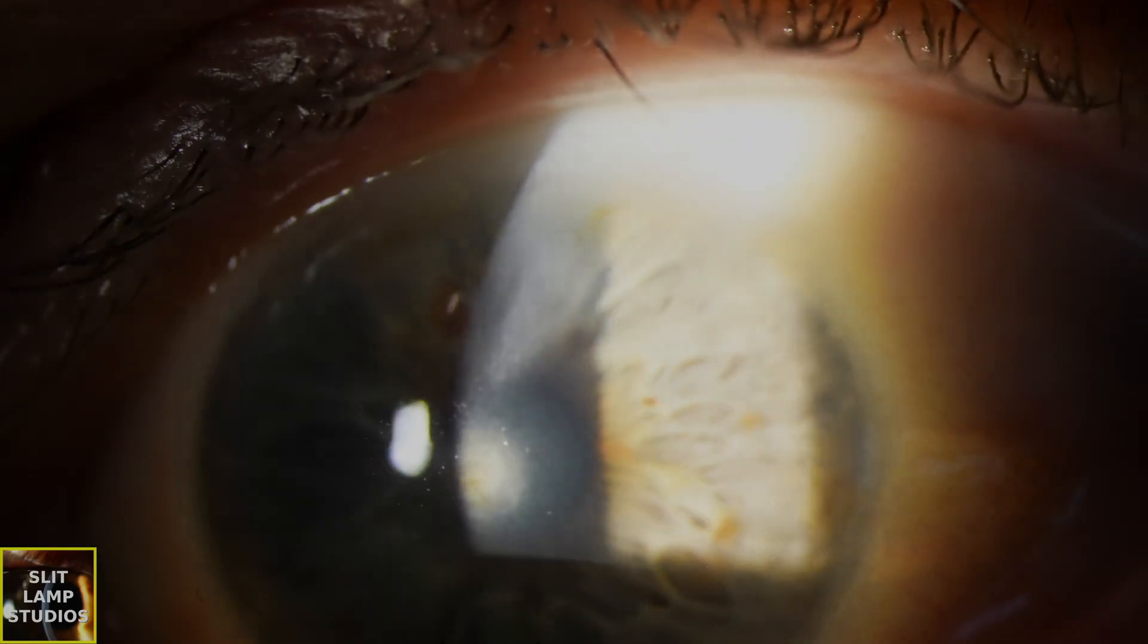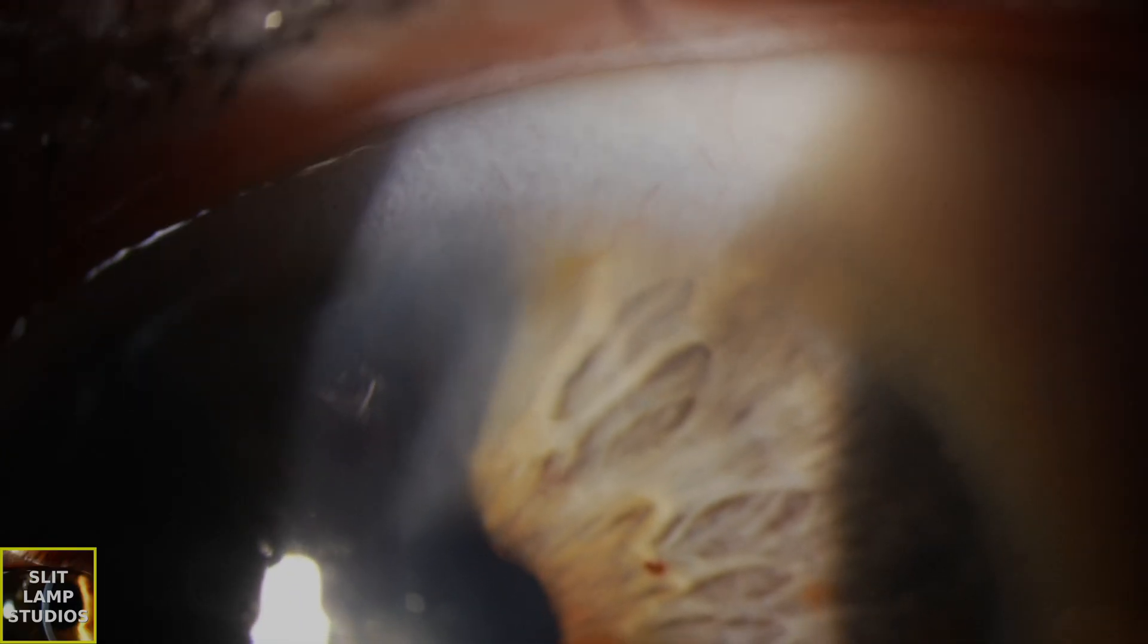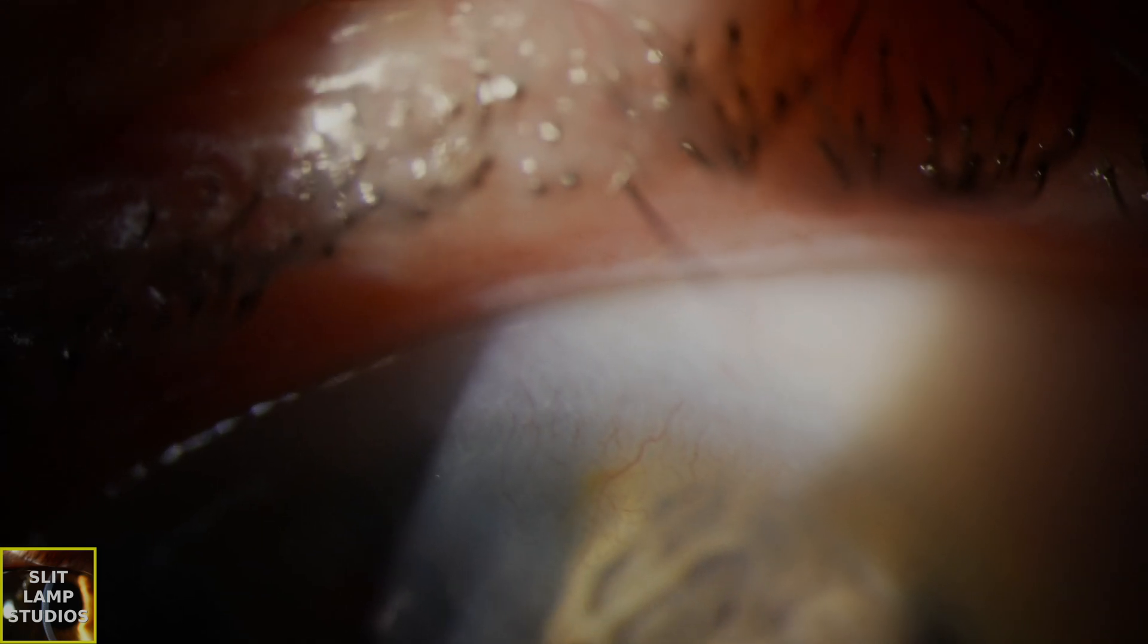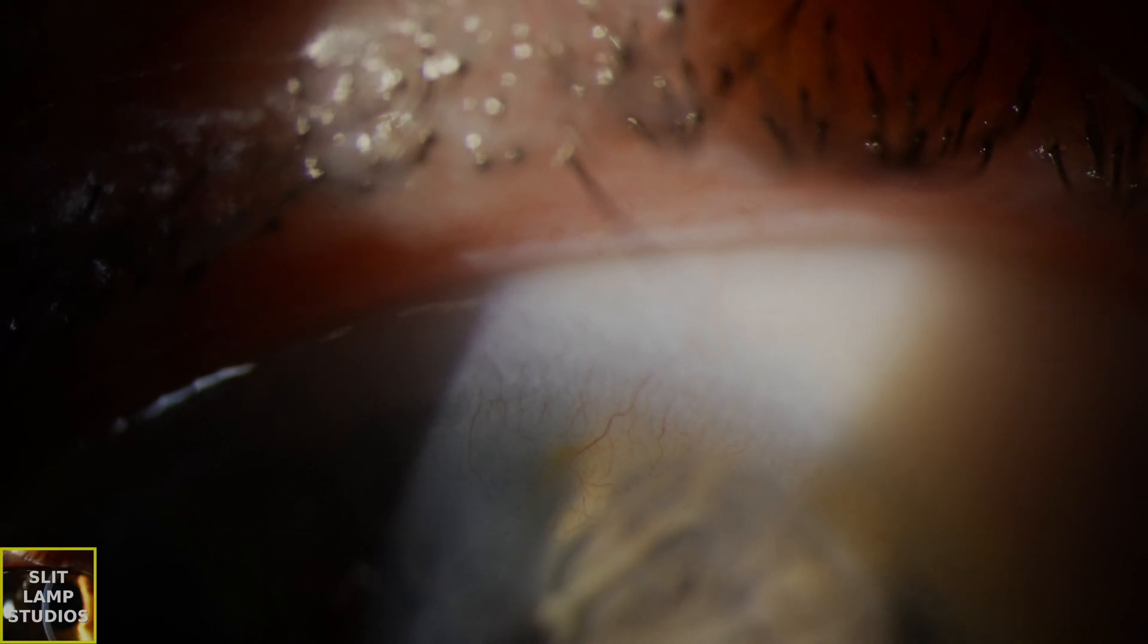You can see that there are some central-involving lesions there and you can see some iron deposition within that central lesion, which tells you the chronicity. You can also see some iron deposition in the more peripheral superior scarring and also some area of corneal neovascularization superiorly.